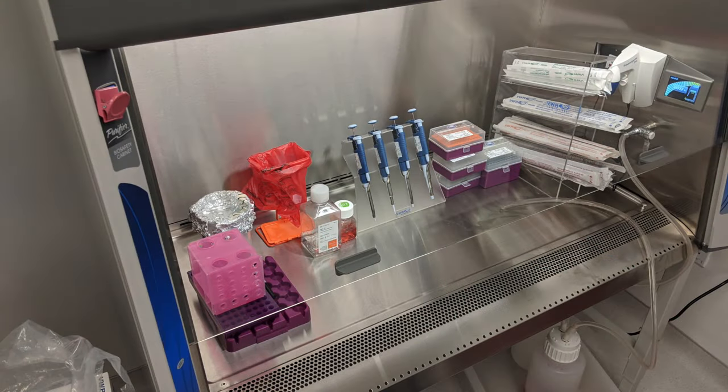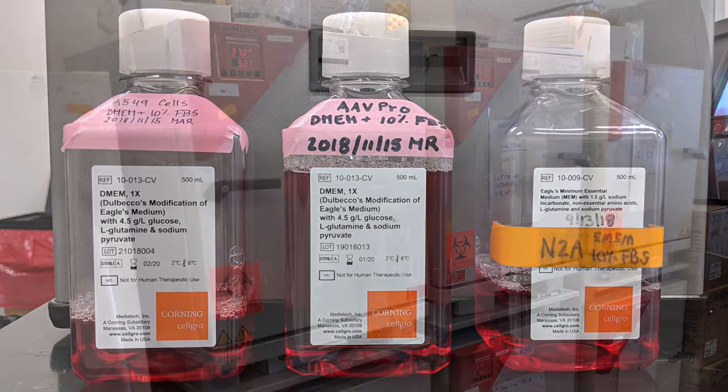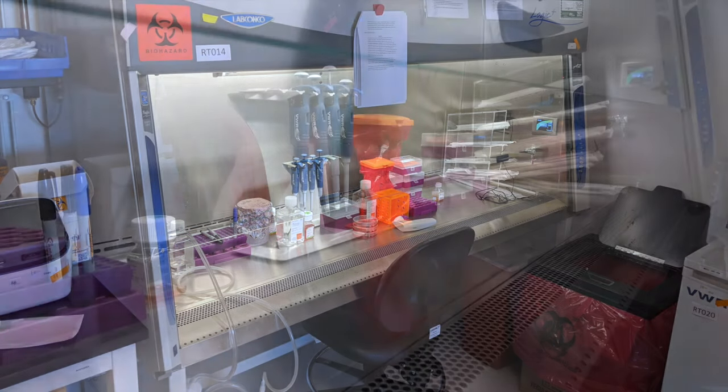Before beginning any tissue culture experiment, ensure that the lab is equipped with all of the necessary materials. Some key instruments include a carbon dioxide incubator, an inverted microscope, and a class II biosafety cabinet.